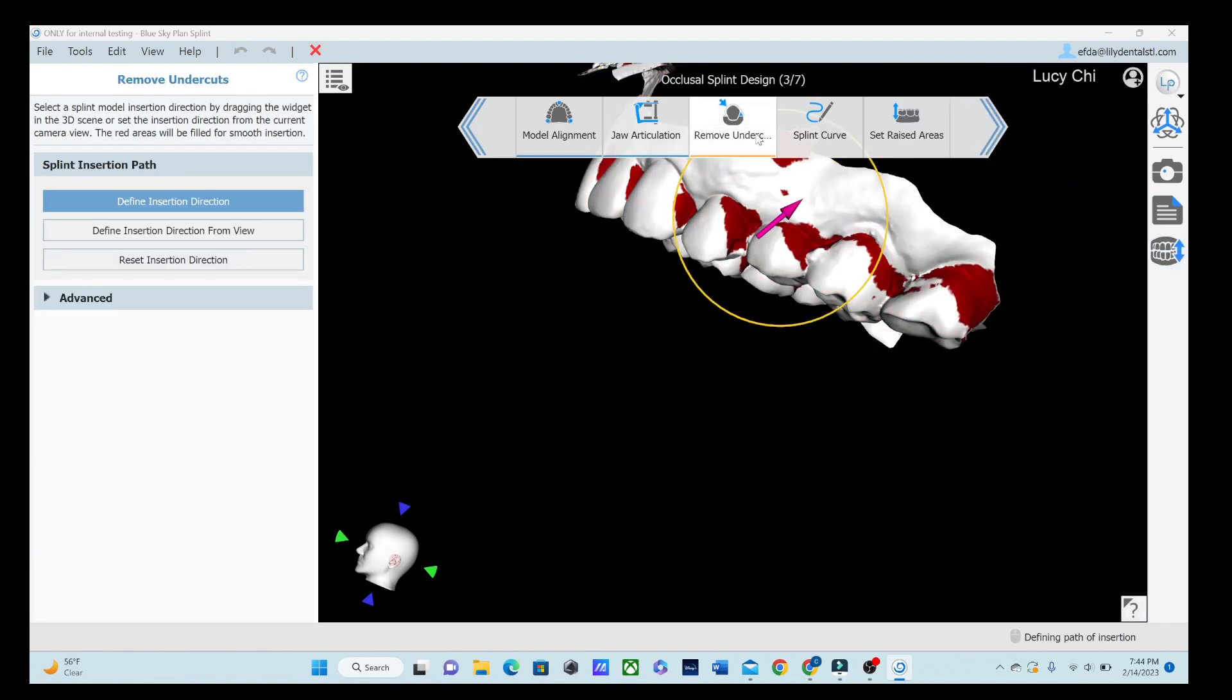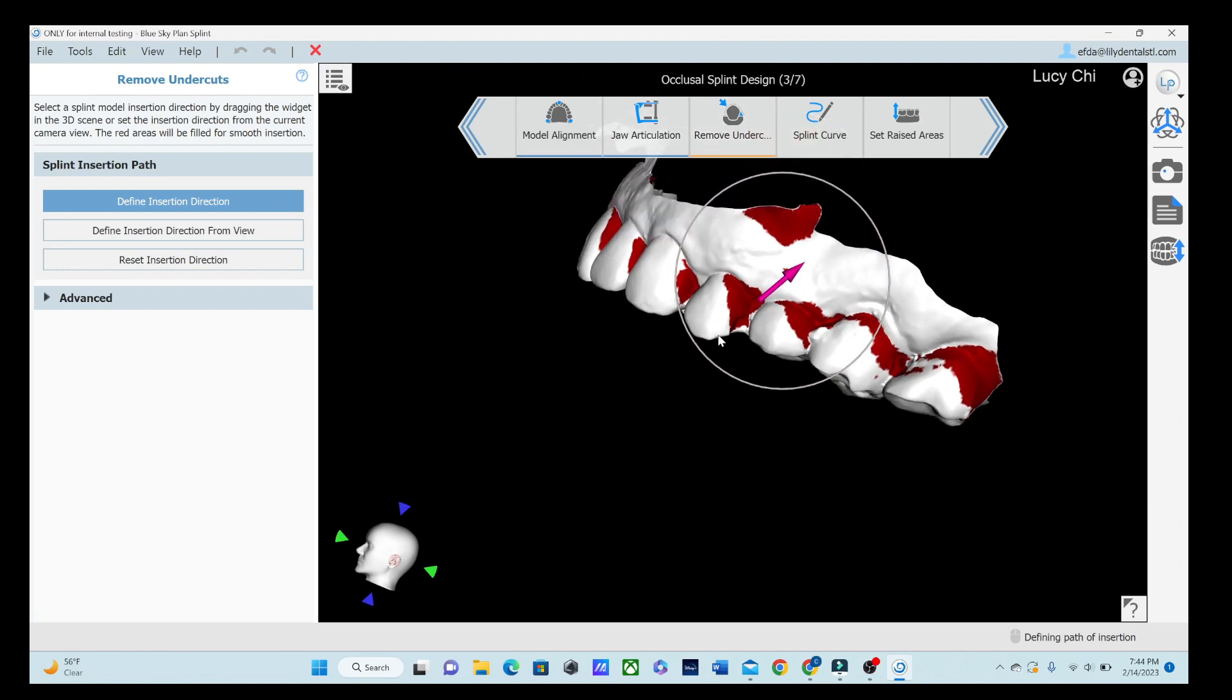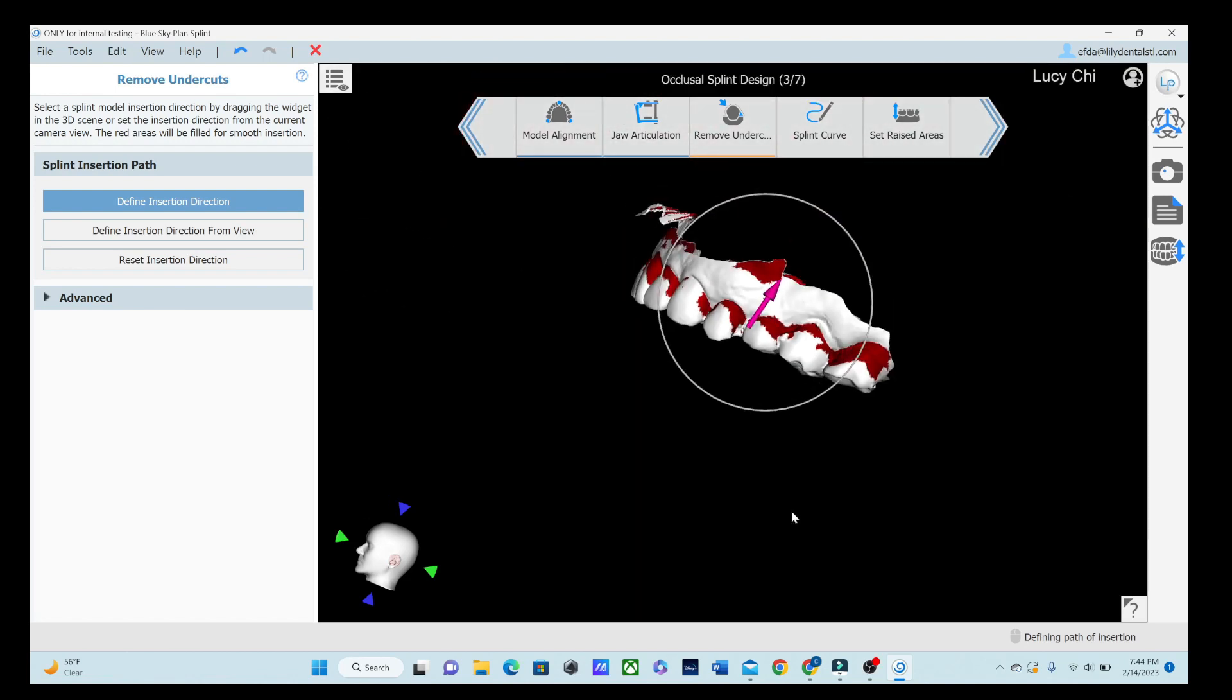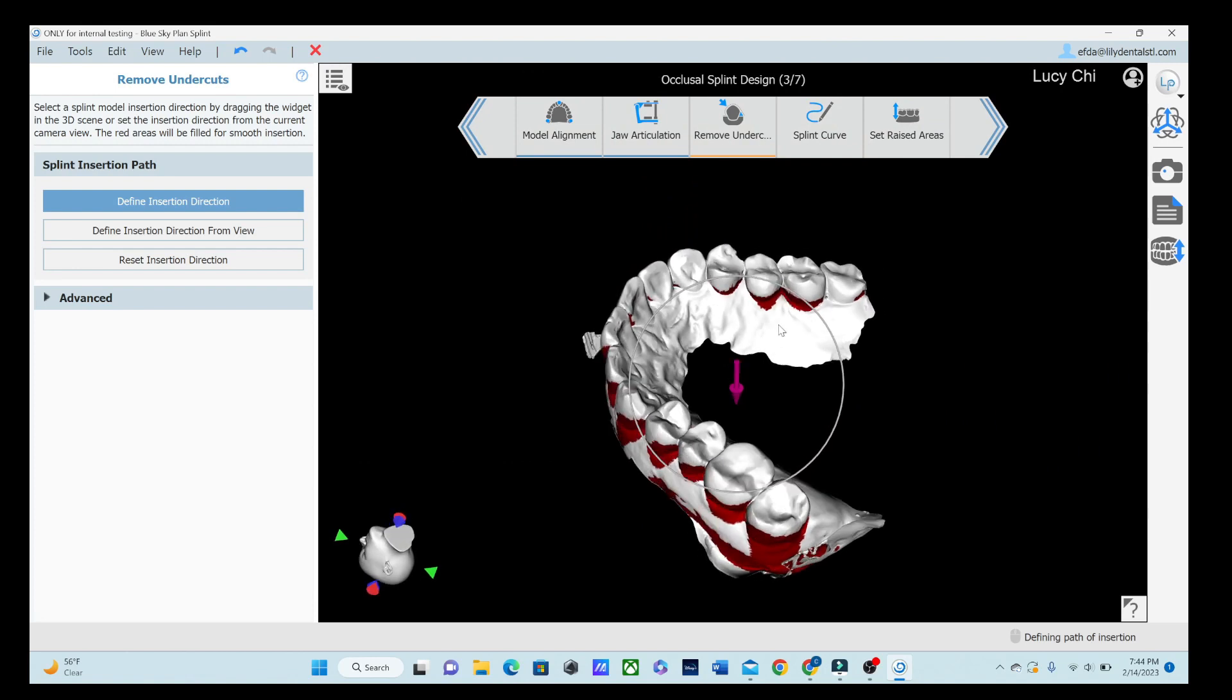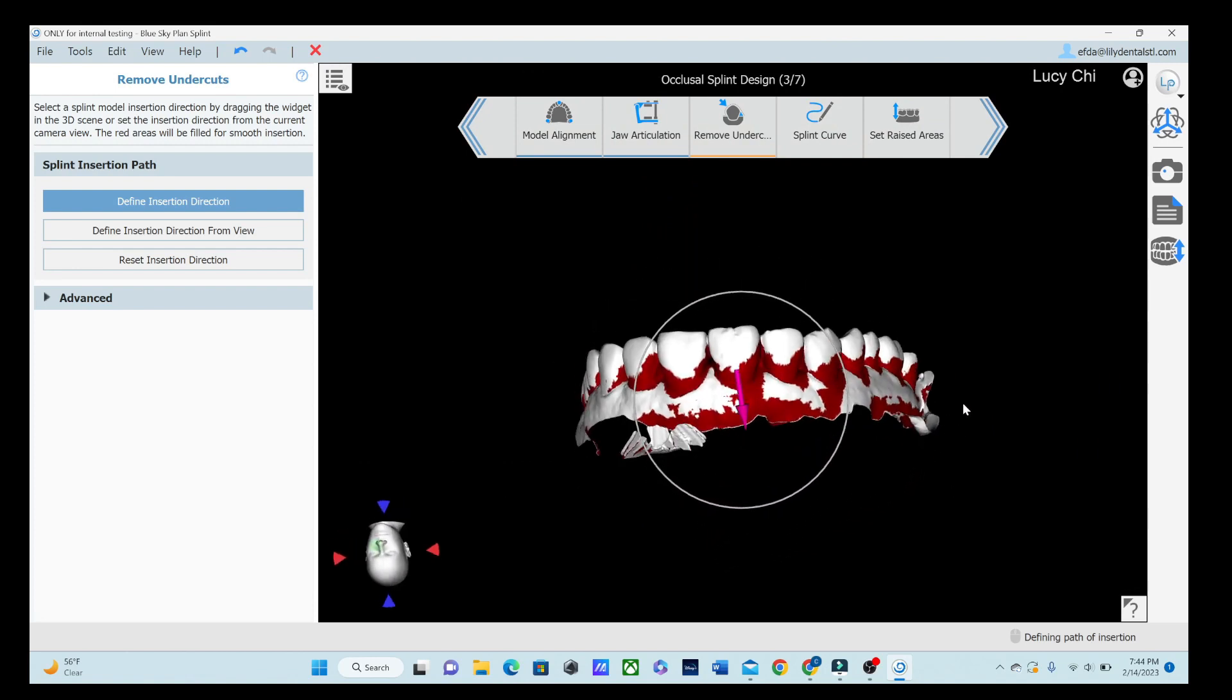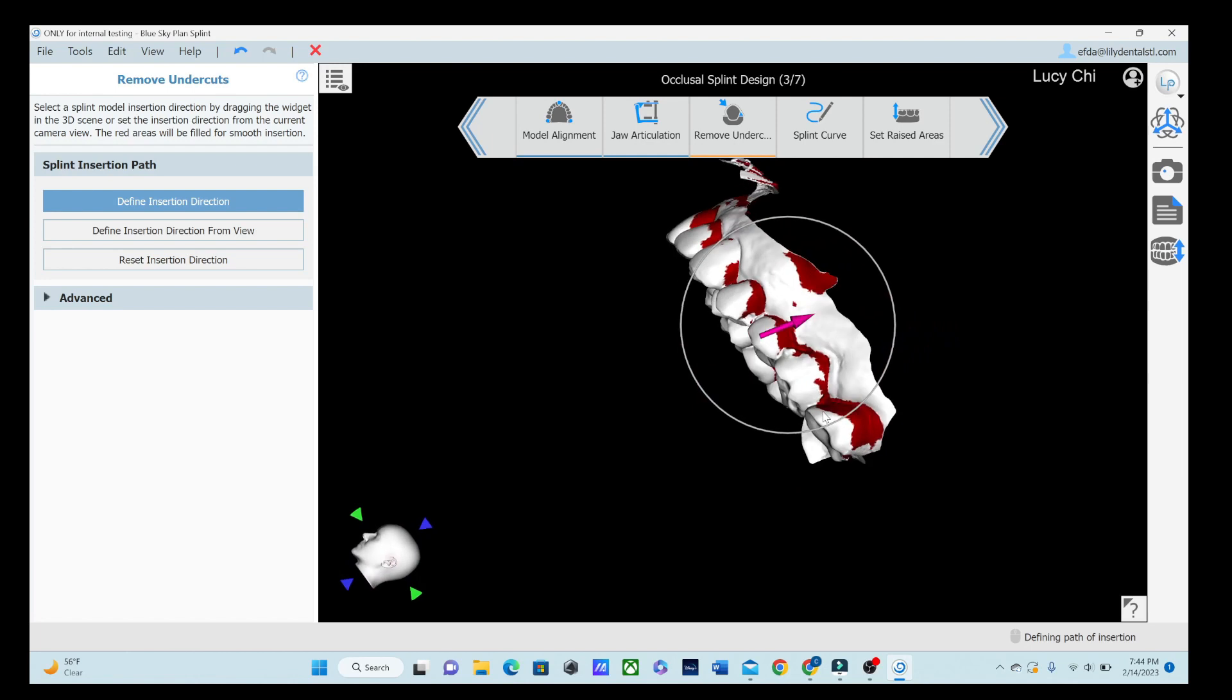Next, we're going to remove those undercuts by defining how it's going to be inserted. And I like my undercuts right across the gingival line because I'm going to be putting my splint right about here. And I want to engage some of those undercuts to keep it in, but not engage too many where the patient can't get it out. That is pretty happy with that one right there.